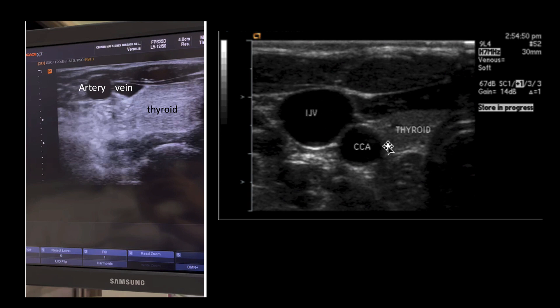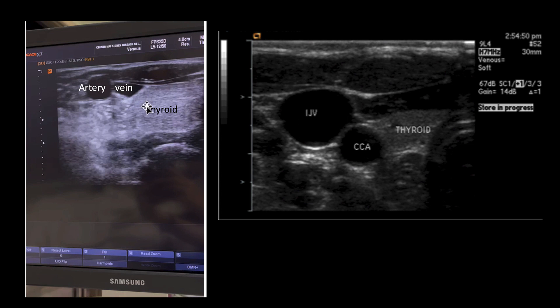So in a normal patient, you would see the thyroid, and then the artery close to the thyroid, and then the vein. But in our patient, you see the thyroid first, and then the vein is close to the thyroid here, and then the artery is lateral.